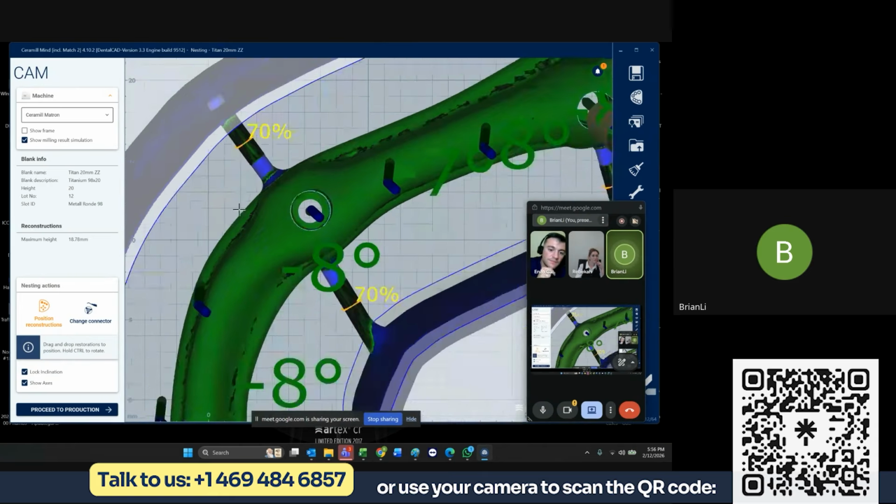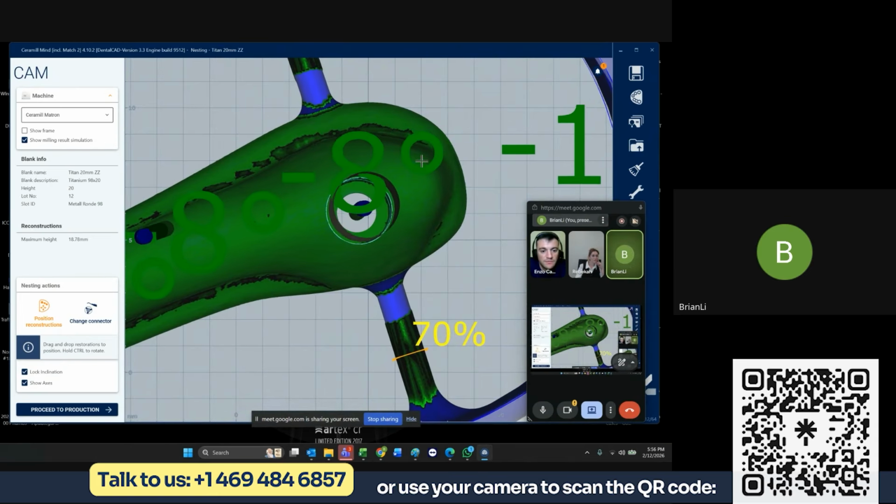That looks really good there. And that one looks good.